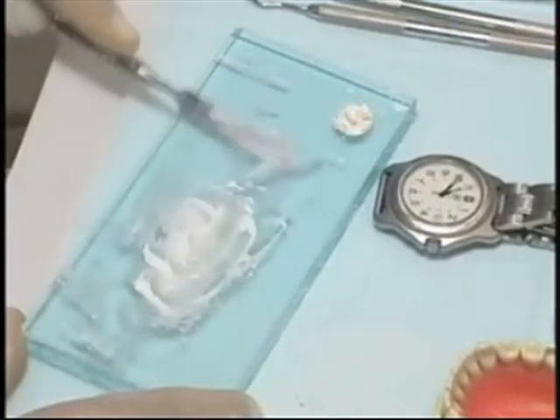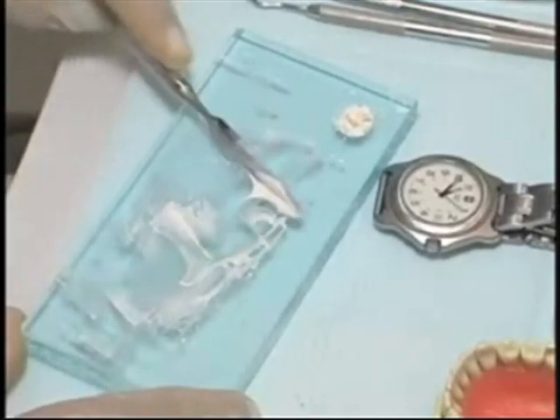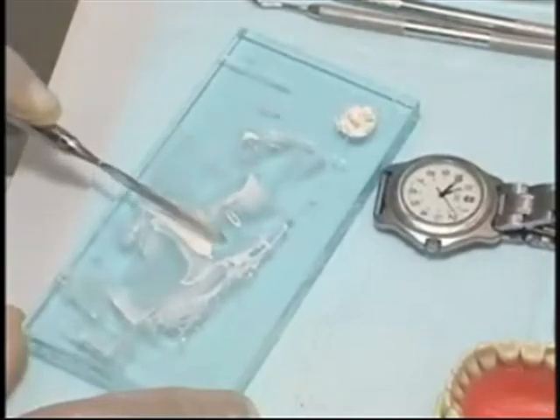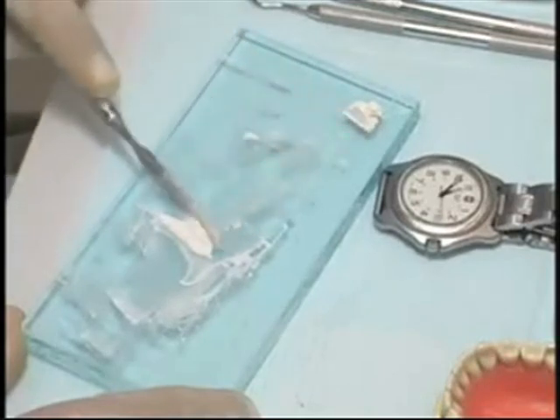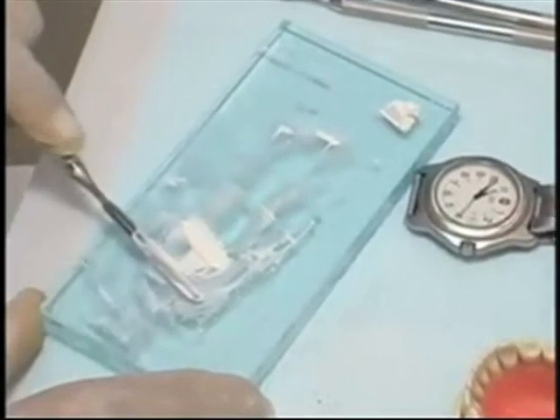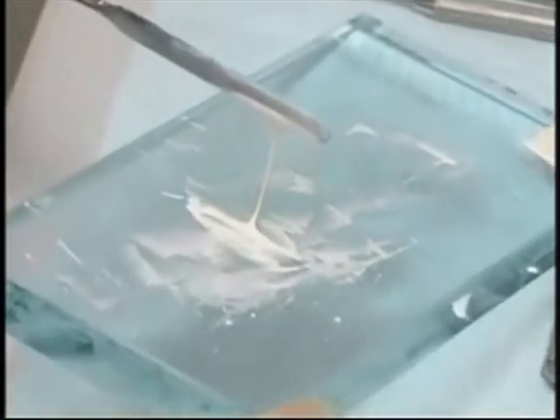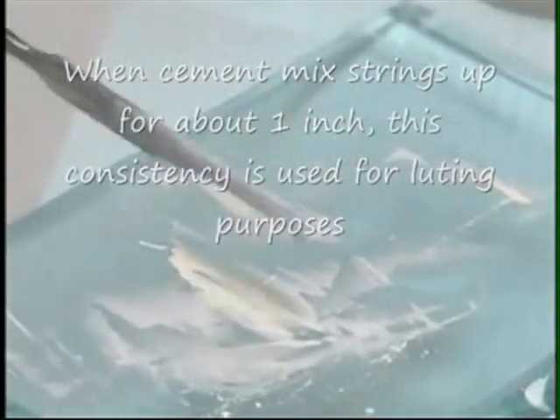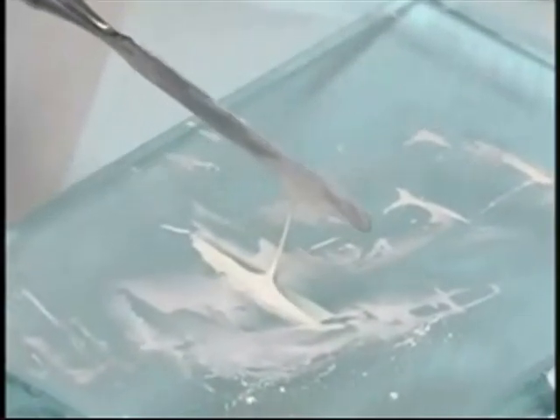A primary consistency is usually attained at the end of 90 seconds. It may be that not all of the sixth portion will be required, or a slight additional amount of powder from the upper corner of the slab may be required to achieve this primary consistency. When the mass is gathered together and the spatula is laid into it and withdrawn, the cement will string up for one to one and a half inches before breaking. The primary consistency mix is used for inlays, onlays, and crown cementation.